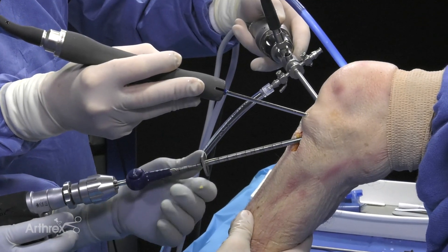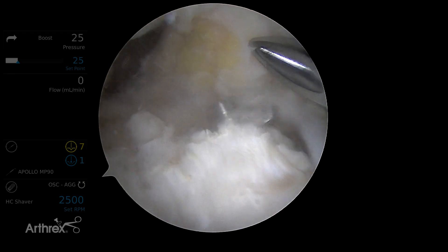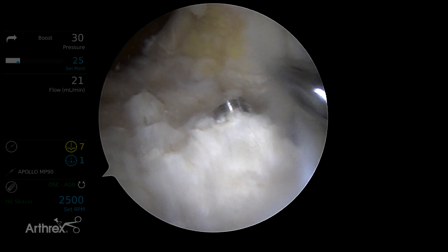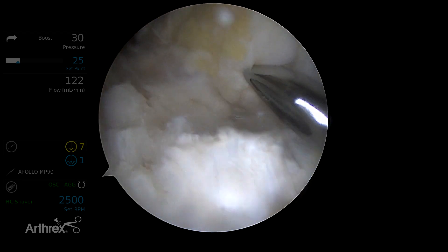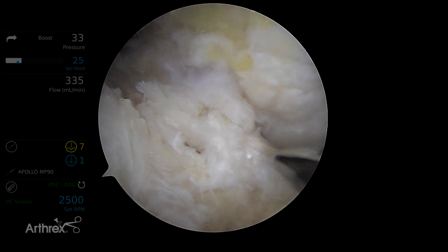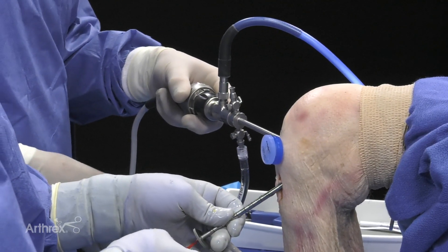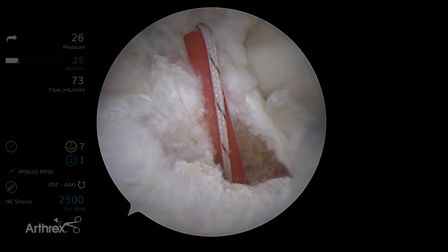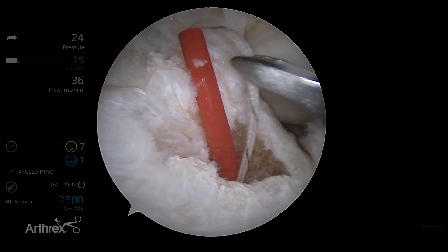Our flip cutter comes out directly where we wanted it in the ACL footprint. We'll retro cut our tibial socket to shave it in place. Get the debris out. Now we're going to pass through our tiger stick. Here's our loop grasper — this will be our shuttle suture on the tibial side.